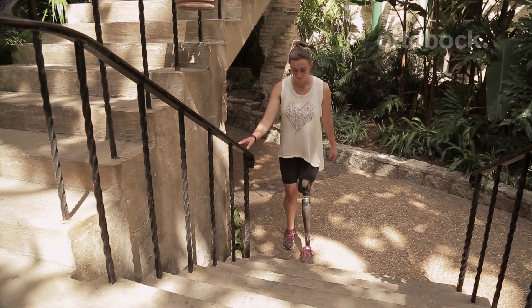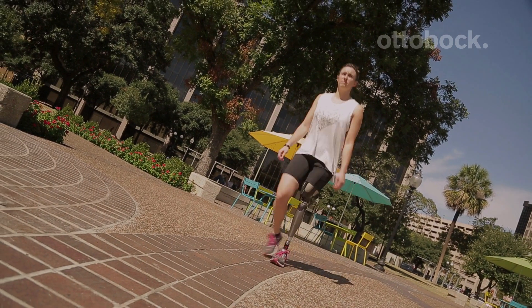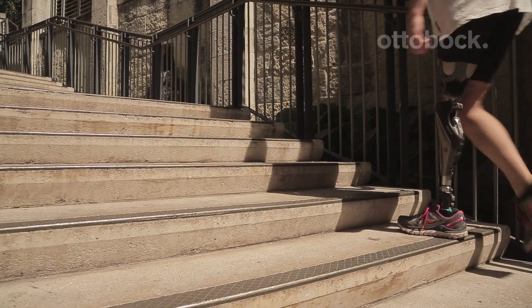Hi, my name is Allie. I wear the Genium. I'd like to teach you how to activate the stair mode. I've been wearing a Genium for three years now, and I have some tips for you to activate the step up motion.